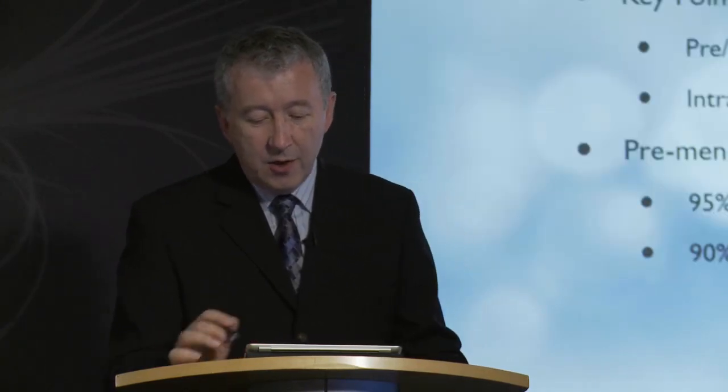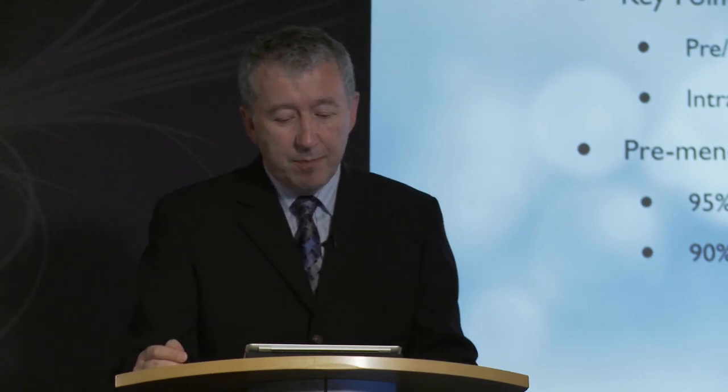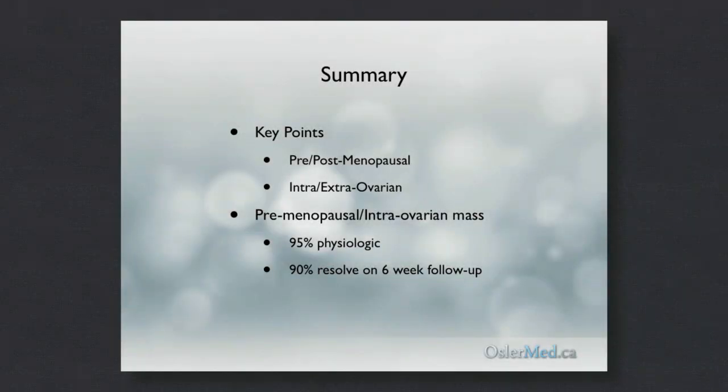So that brings me to the end of part 1. I'd like to emphasize the key points. On clinical history, is the patient premenopausal or postmenopausal? On sonomorphology, is the adnexal mass intraovarian, that is arising from the ovary, or is it extraovarian?